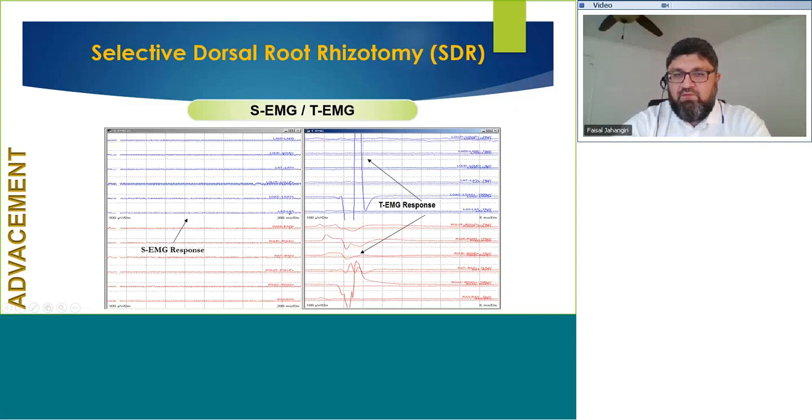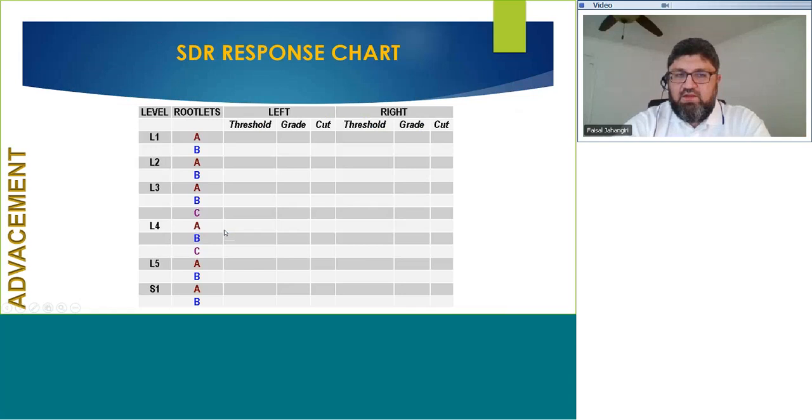with rehab. There are thousands of cases done, Park et al. and others have published a lot of data on that. So the use of surgical neurophysiology for cerebral palsy patients has absolutely great outcomes. Patients can walk and run postoperatively.